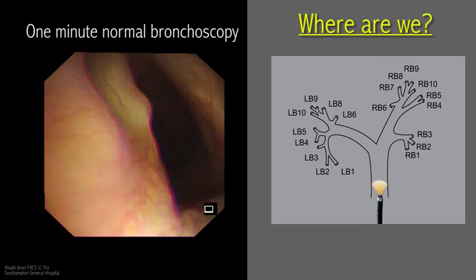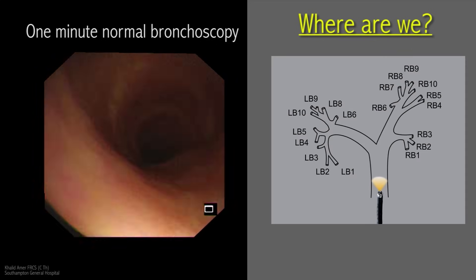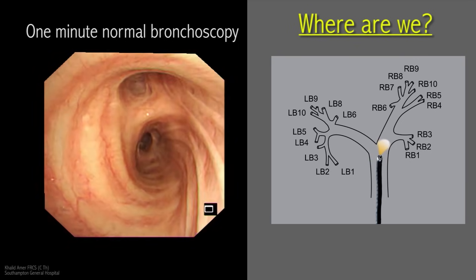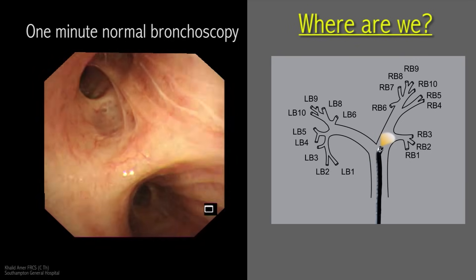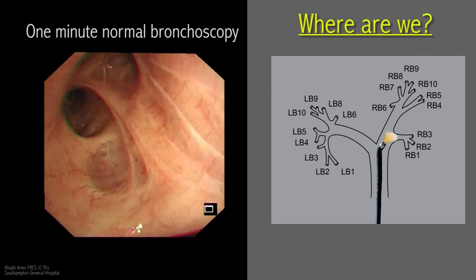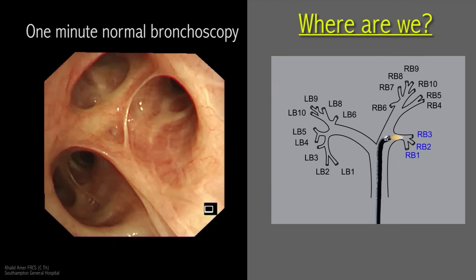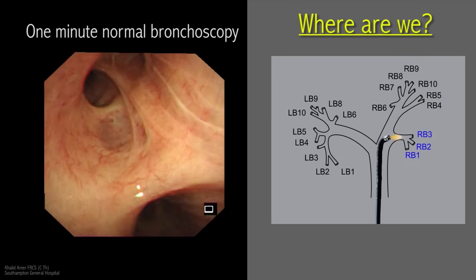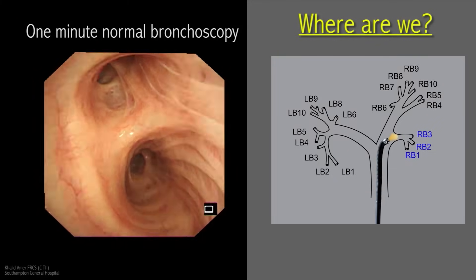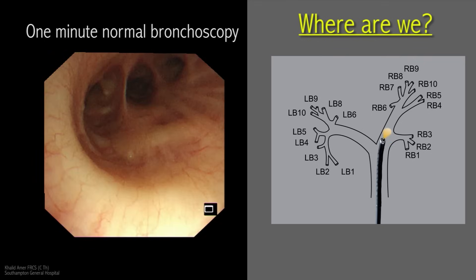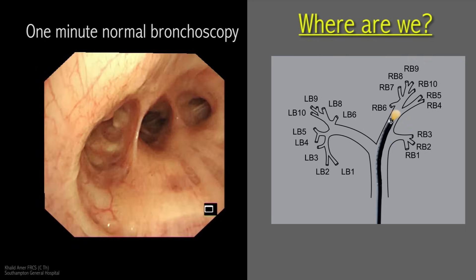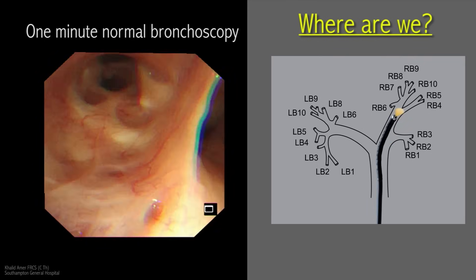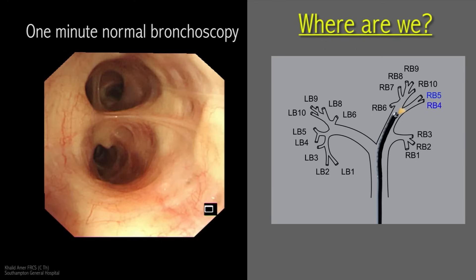The screen will be divided into two halves. The left half with the black background will show the bronchoscopic steps of a continuous clip of normal bronchoscopy, whereas the right grey half of the screen points out what to look for, alternating with a real-time map of the anatomy of what is seen on the left side.